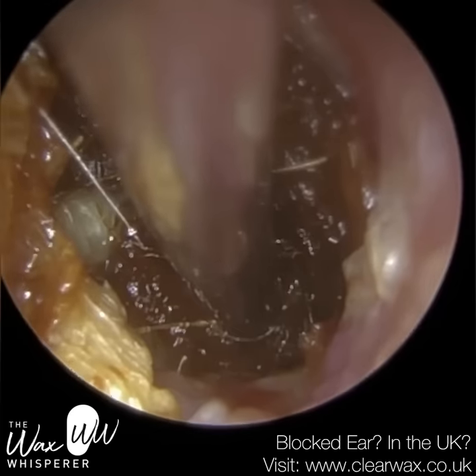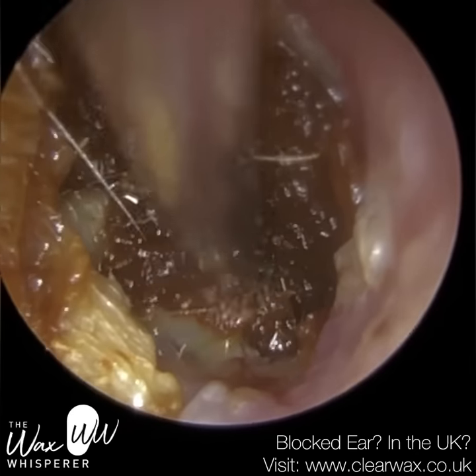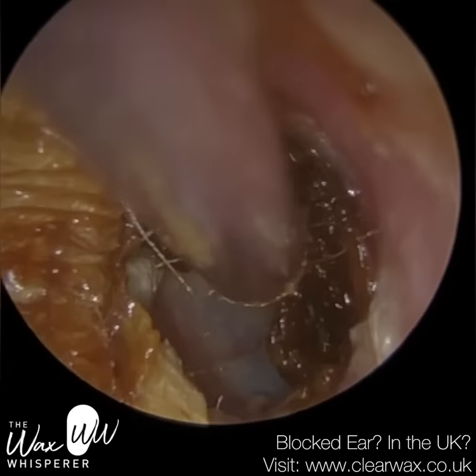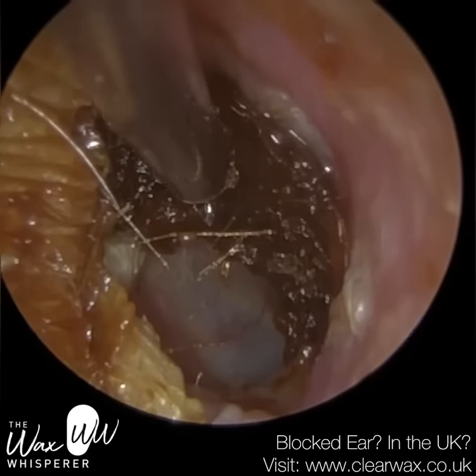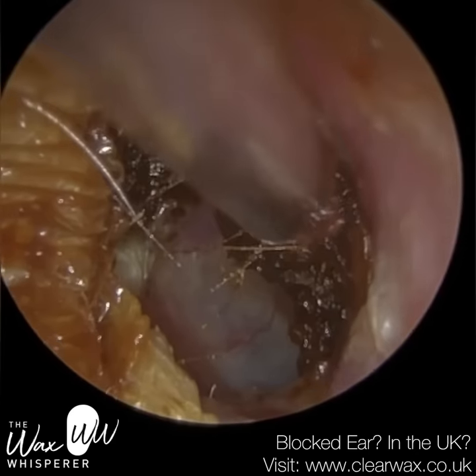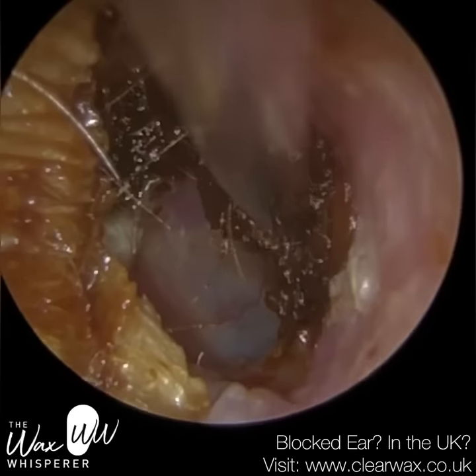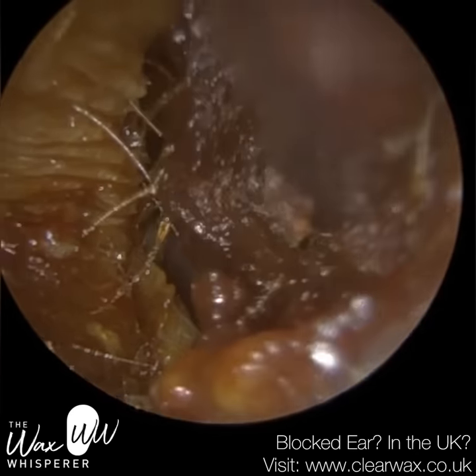Clarinetting — it's best to avoid that. One way of avoiding clarinetting is to use the fine end; you're far less likely to get any clarinetting, and if you do, it's a lot quieter. So I've just curled the tip of this fine end — it's a slight curl there, and that's to help me get into this region here. If I didn't curl the end, when I'm removing wax from the anterior canal wall, the suction probe would possibly make contact with the bony section of the anterior canal wall, which is very delicate and sensitive. So by curling it, it just helps me avoid making contact.